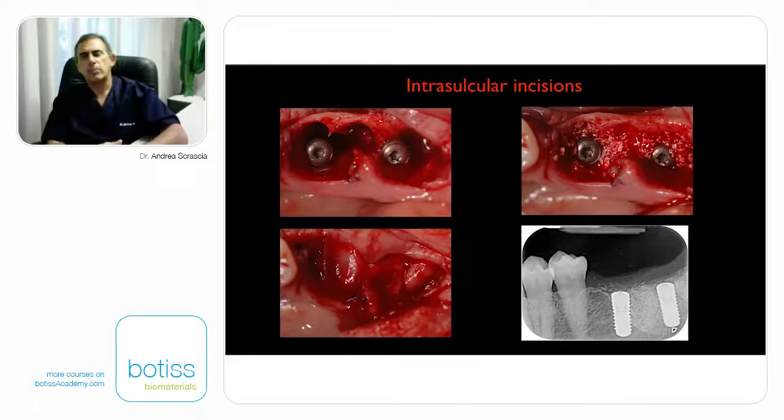After this, I proceed to insert the implants immediately after the extraction in an ideal position, filling the intrabony defect using heterologous bone and positioning 2 layers of reabsorbable membranes under epithelialization of the periimplant thick tissue.